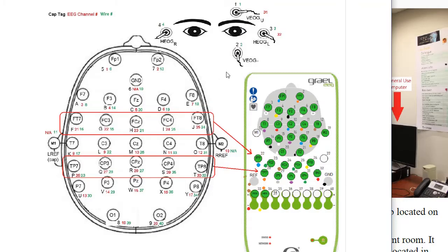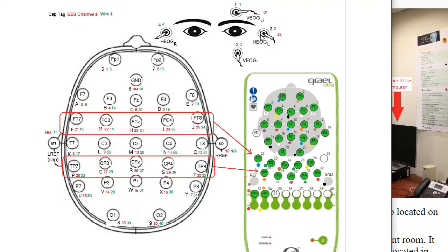Okay, this diagram shows you the electrodes that we use in our ERP lab. So we have a bipolar vertical oculargram and a bipolar horizontal oculargram using those electrodes, and these electrodes hang down and wires from the cap.